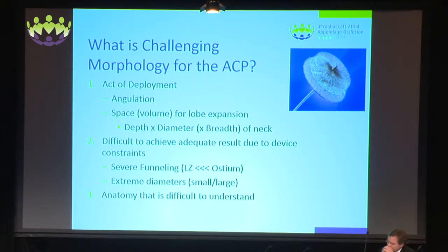And the third thing is that the anatomy is difficult to understand. That's a challenge for me because I have no idea whether I can achieve 2, and if I can achieve 2, whether I can achieve 1, whether I can get where I want to go.